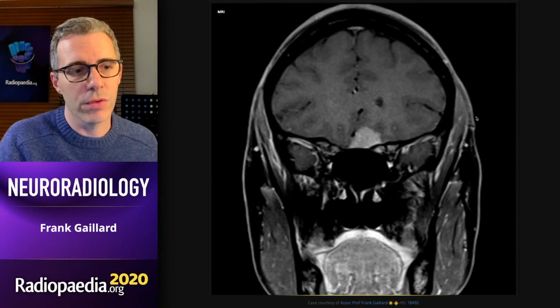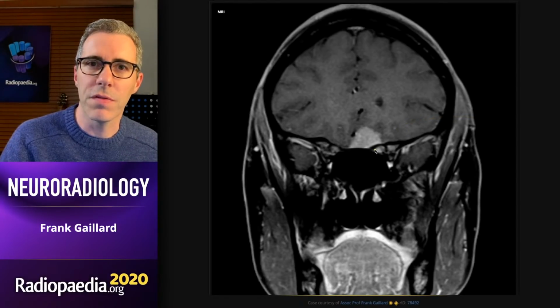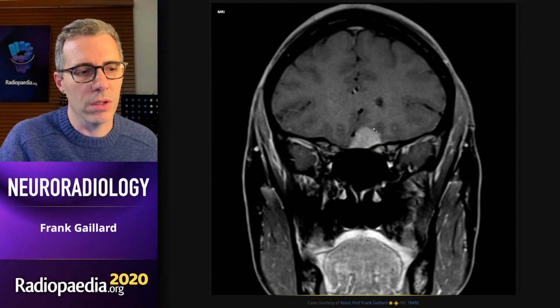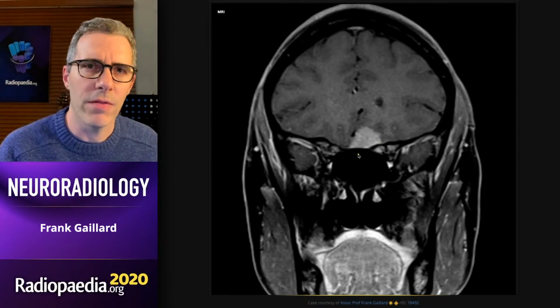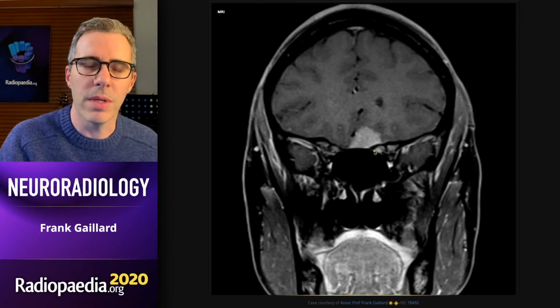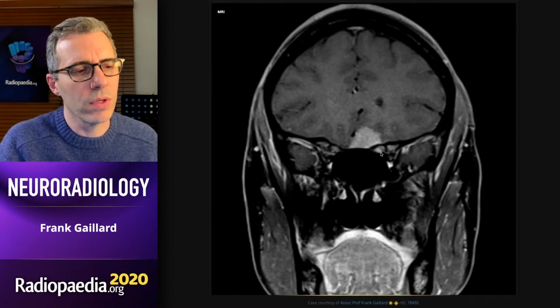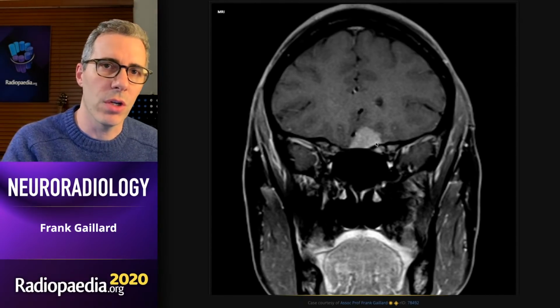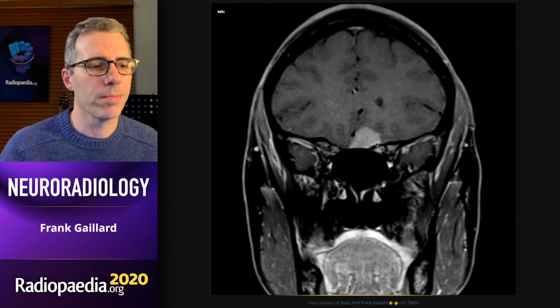If they come from a lateral approach, then they'll be looking at the meningioma this way and they're not going to de-roof the optic canal to try and get to this, which is on the other side of the optic nerve, which is stretched over the top. And if, as increasingly is the case, you might have a transnasal endoscopic approach that way, well, you're certainly not going to be deliberately opening up into the optic nerve canal. So it's really important as radiologists to identify on all your scans that have meningiomas in this region whether there is tumor extending down into the optic canal.